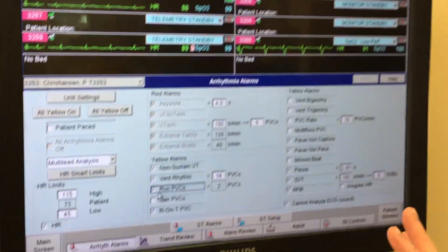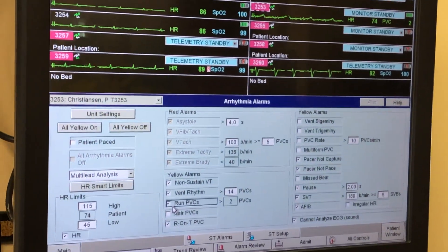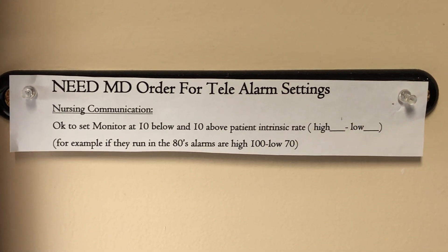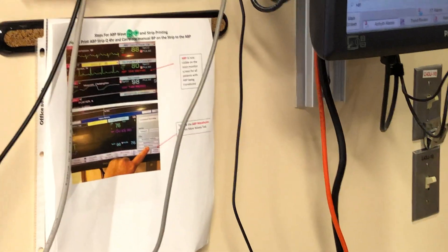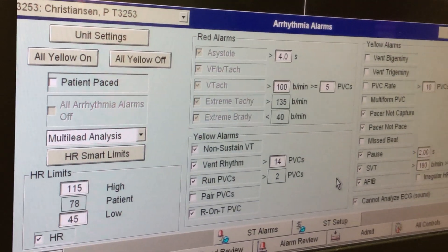We don't usually change any of this either, unless someone is bradycardic with a heart rate living in the 50s. Per policy, we need an order from the transplant team to set the monitor 10 below and 10 above the patient's intrinsic rate. We get an order and then go into the arrhythmia alarm window, which gives you all of these settings.